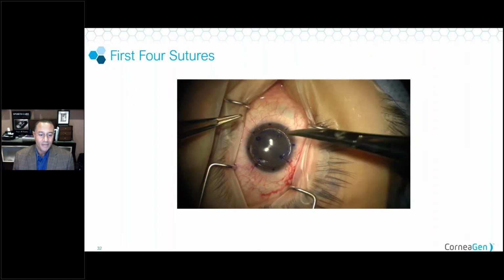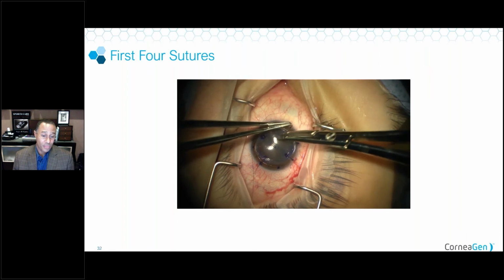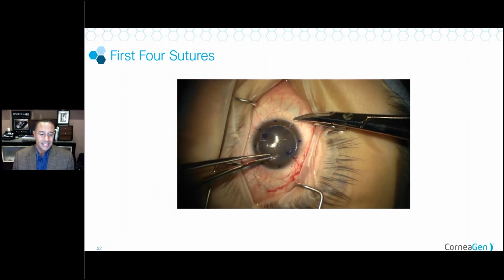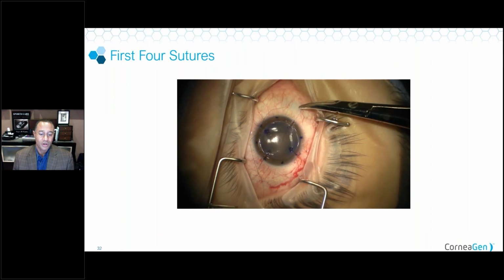So here I've got my first 2 in. You'll see stretch as we're flattening the cone. Now I've got 3 in. I'm placing the 4th here. And as you place the 4th, and tighten that suture up, you should see those stria in the center flatten out.